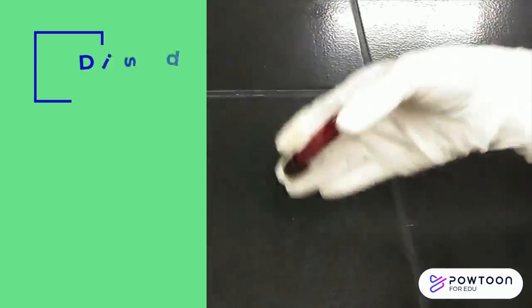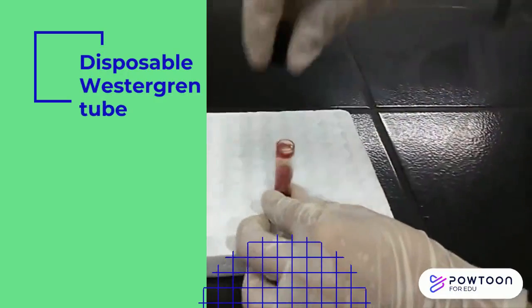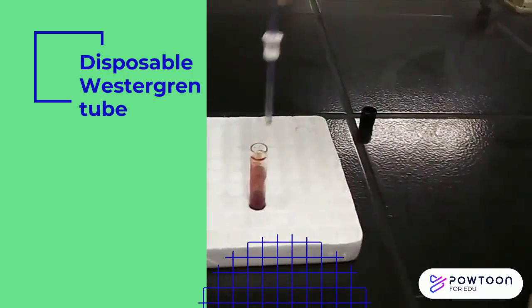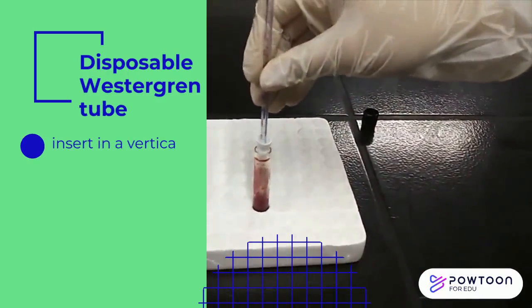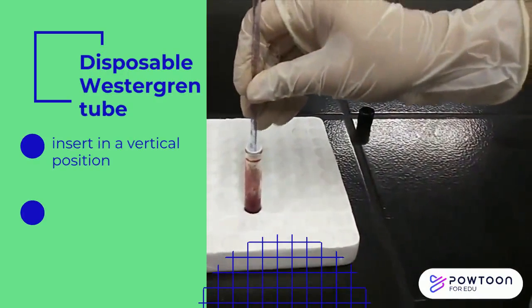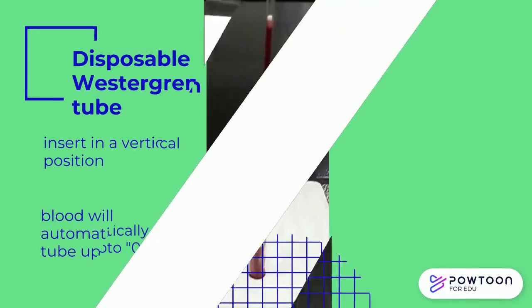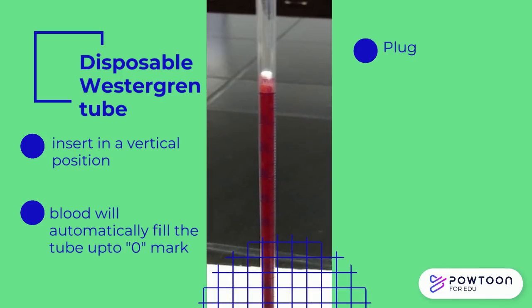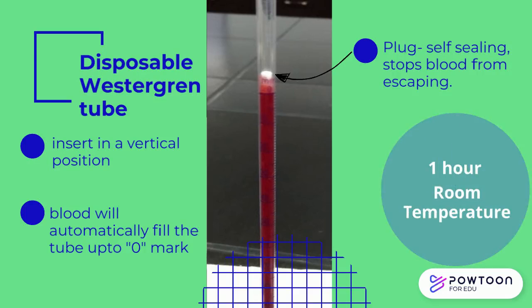Procedure using a disposable plastic Westergren tube: for the first type of disposable pipette, simply remove the cap of the evacuated tube and insert the Westergren pipette in a vertical position. Blood will automatically fill the pipette up to the zero mark. The plug is specifically designed to be a self-sealing aerosol barrier that stops blood from escaping through the top of the pipette. Let it stand undisturbed for 1 hour.